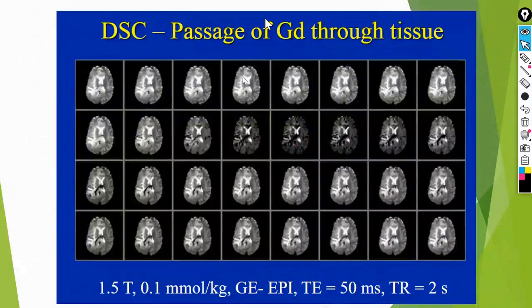This form, which is the dynamic contrast scan, involves taking perfusion, allowing you to see the blood flow or observe the contrast agent moving through the tissues. They always use a sequence called echoplanar imaging in this context, which is considered a gradient sequence. It remains a very quick examination that takes multiple echoes and observes the flow of the contrast agent within the organ or tissue you want to study.